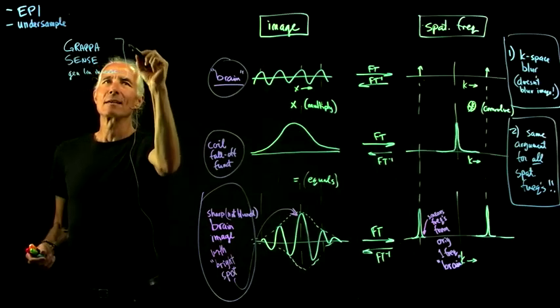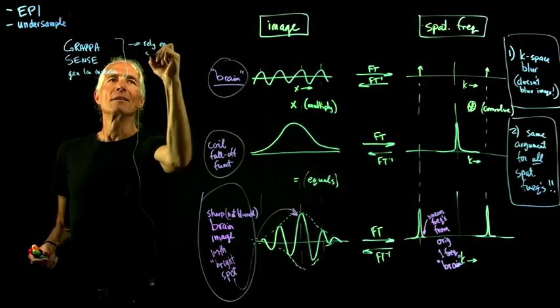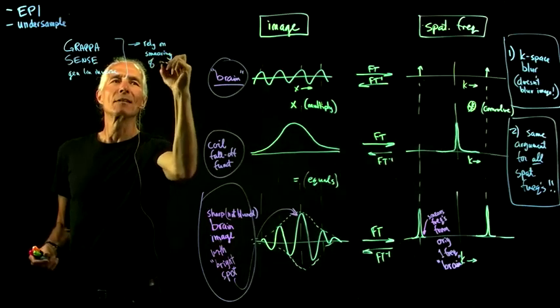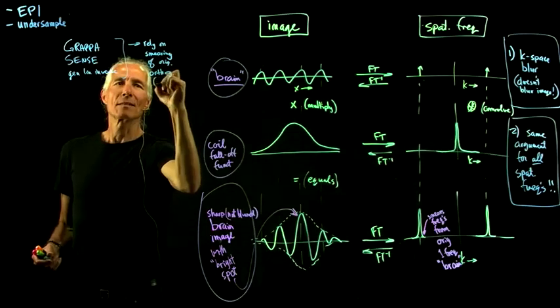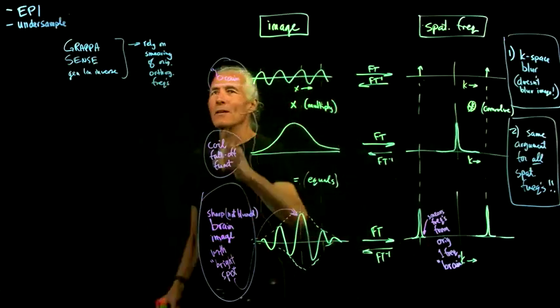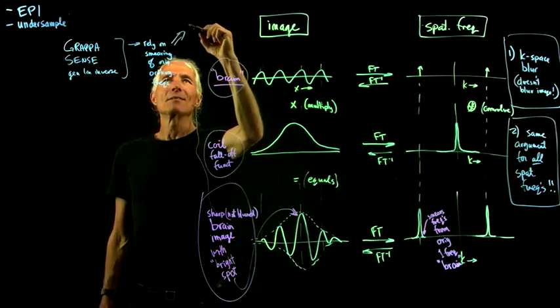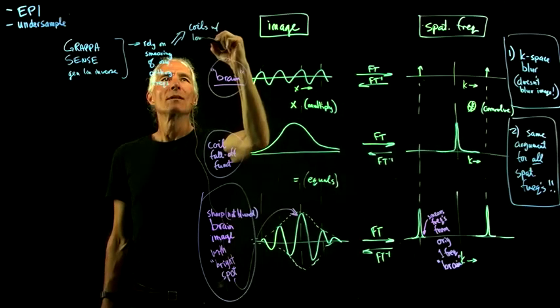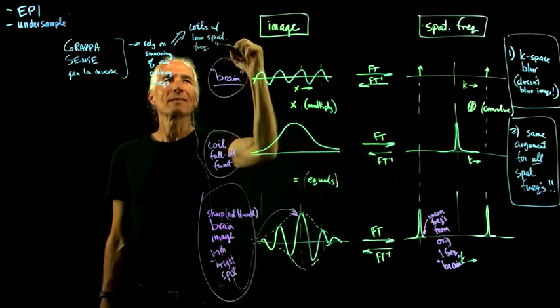All of these things rely on smearing of originally orthogonal frequencies. What's causing this is coils with low spatial frequency bright spots.